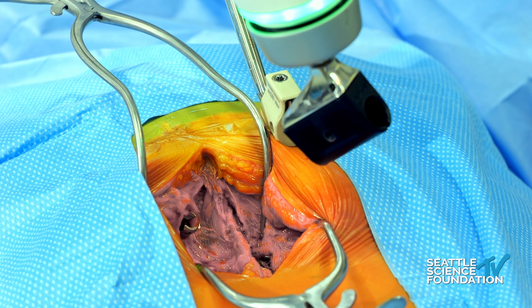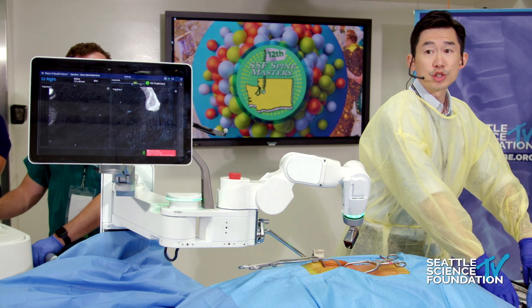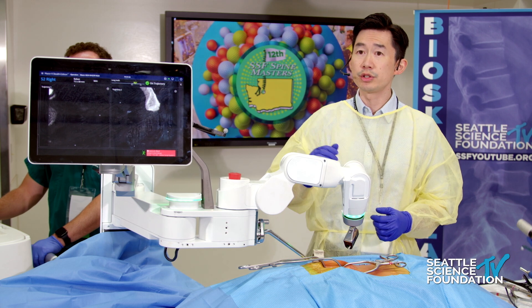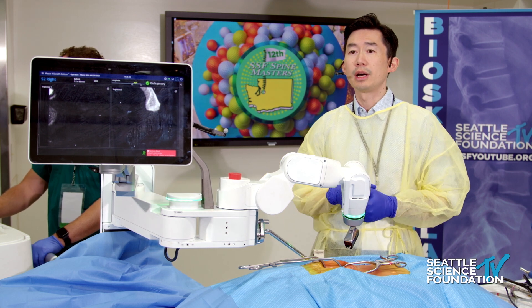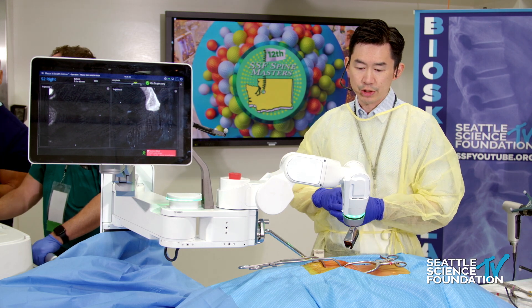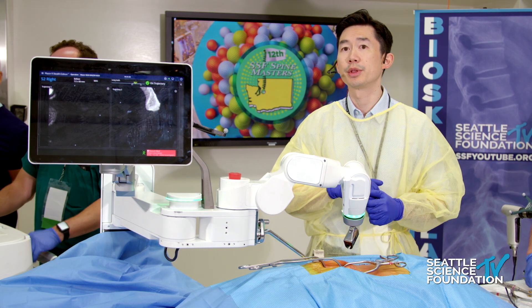As I showed through some of my cases, this is just one S2 AI screw. If you're doing a very complex revision, you can put in two or three S2 AI screws — it's purely in planning the robotic system to make sure you have space and that everything lines up with the rest of your deformity.